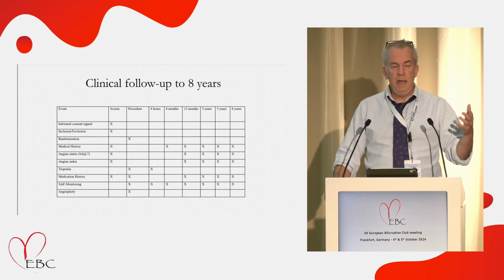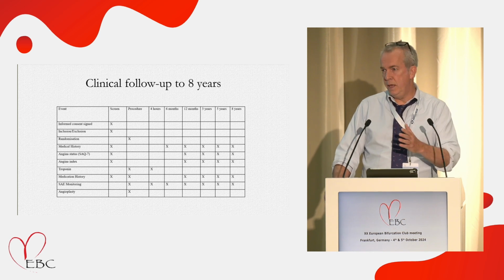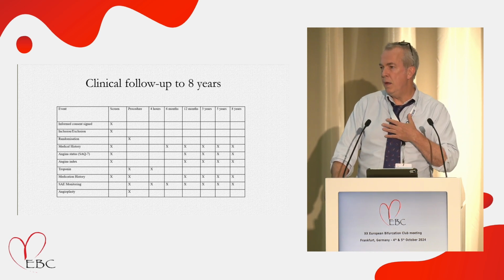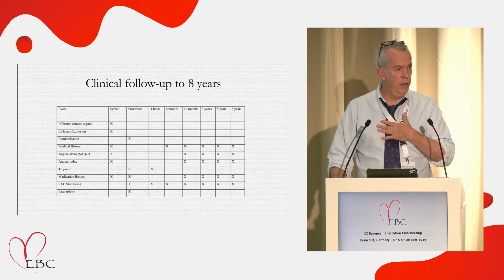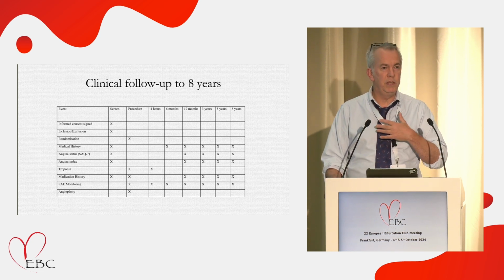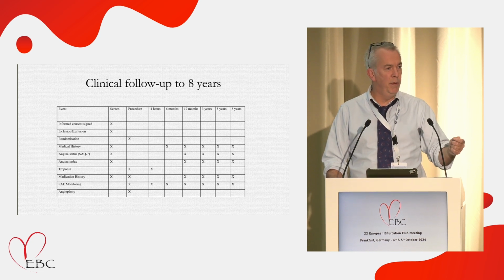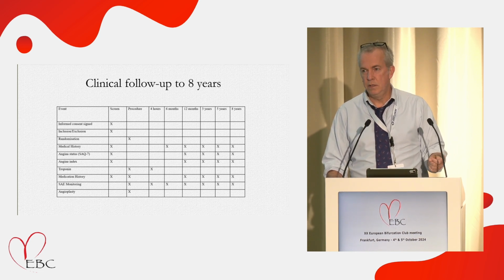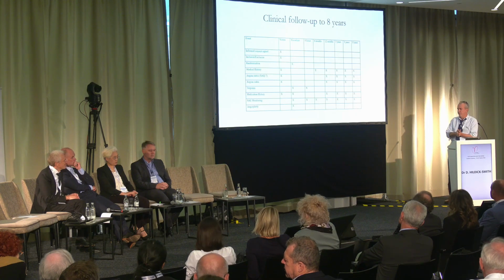Do we get at least non-inferiority using drug-coated balloons compared to stents? Because from my point of view, if we get non-inferiority, then the drug-coated balloon is by miles a winner, because it has lots of ancillary benefits to not having that permanent metal implant in your arteries. Okay, that's the end of my presentation. Open for discussion. Thank you.